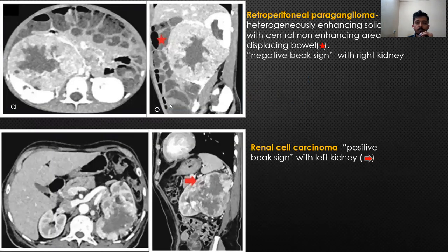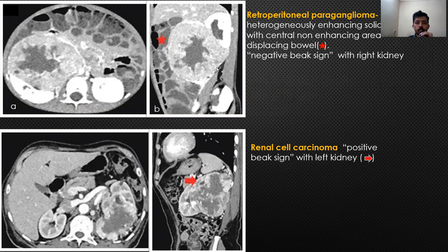Let's briefly talk about a few of the imaging features of retroperitoneal tumours. The first case showed large heterogeneous lesions with non-enhancing areas noted in the retroperitoneum, with a negative beak sign with the kidney, suggestive that it is not of renal origin.